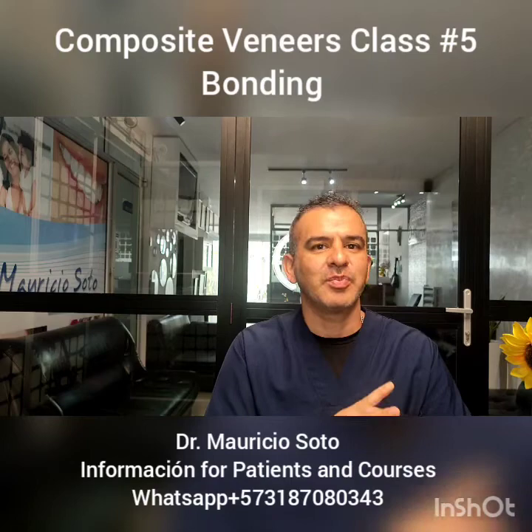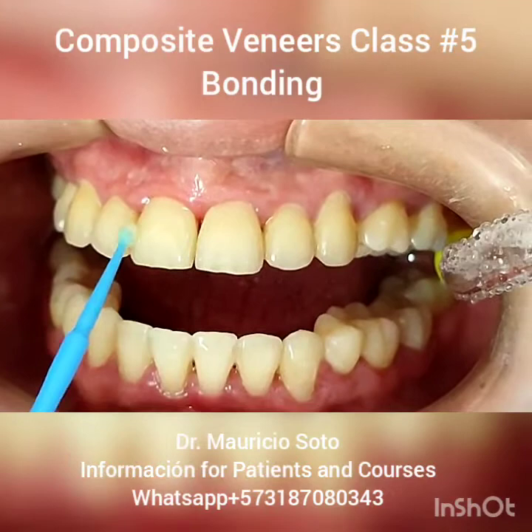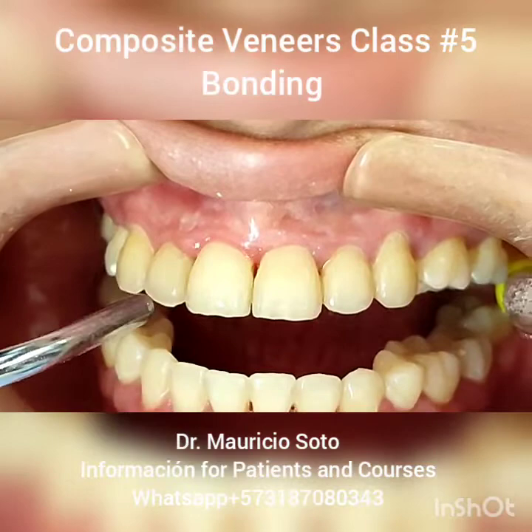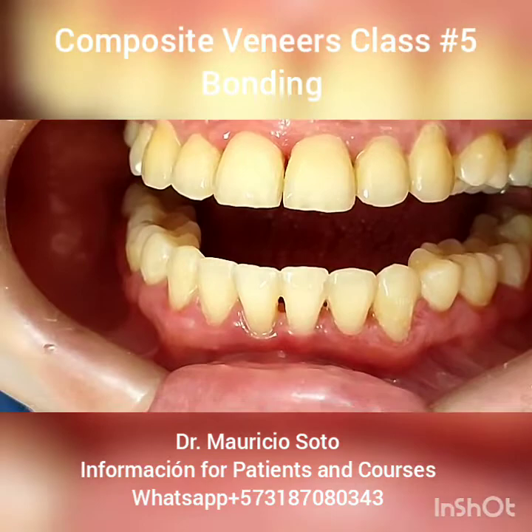The next step after acid etching is to put bonding onto the surface of the tooth. You need to brush very well all the surface. After that, put a little air to spread the bonding in a better way. Now you need to use a photocuring light for 20 seconds.